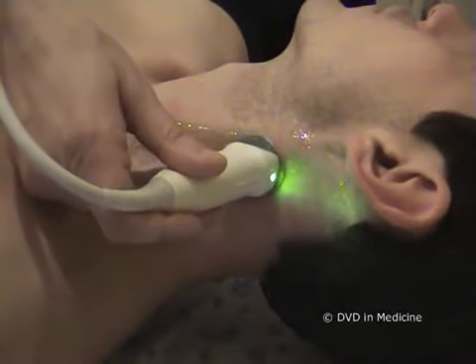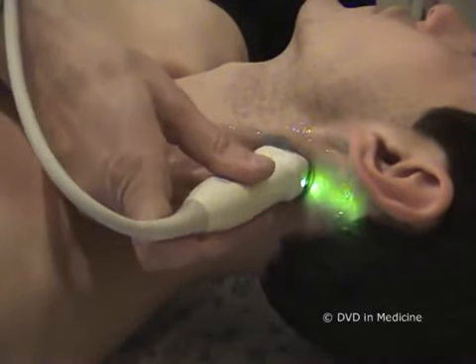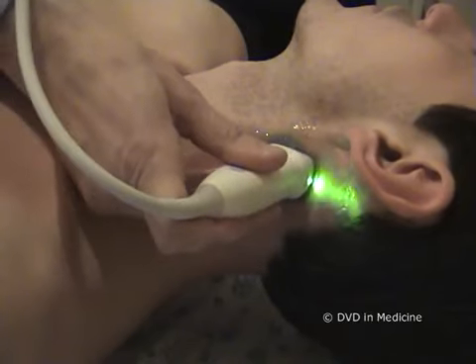We are also able to completely visualize the course of the internal carotid artery to the point where it enters the skull.